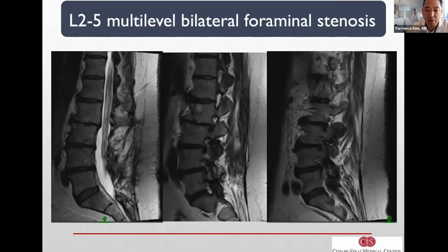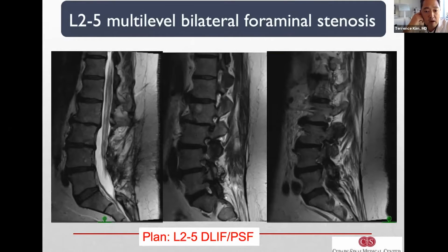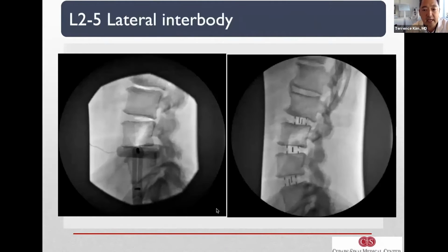And these patients go through quite the ringer with me before they decide to have a surgery. And in my hands, I'm finding more and more, this used to be done 10 years ago when I first started, but nowadays this is more a lateral trans-psoas, multi-level, indirect decompression, posterior spinal fusion. So as we take this case through that robotic navigated case, you can pare this down to a 1 level, or 2 level, or 3 level.